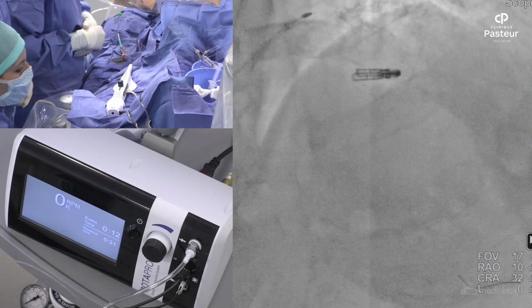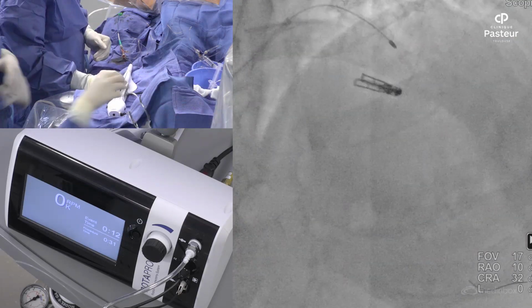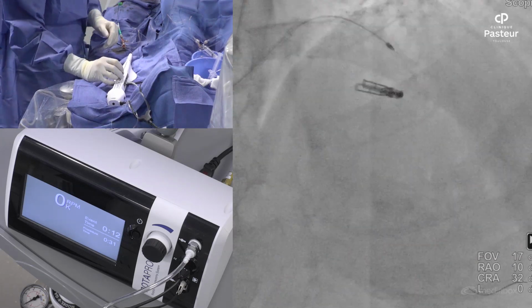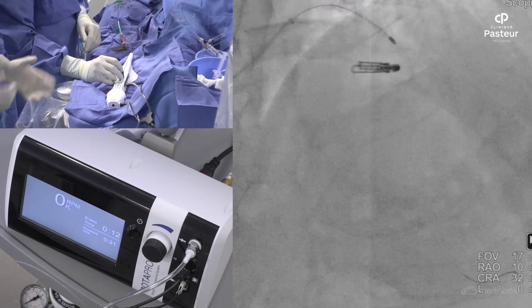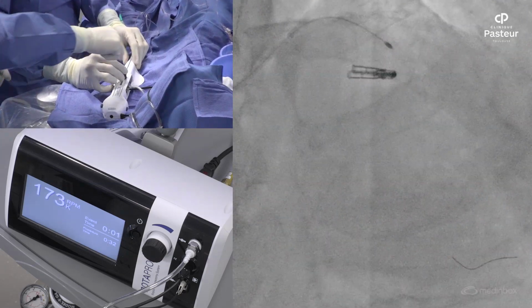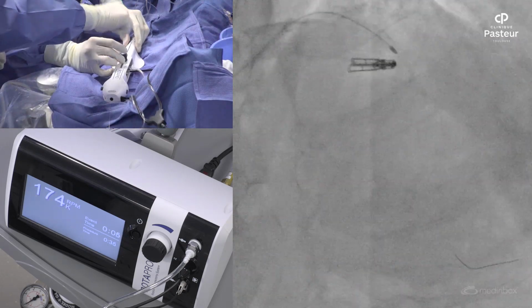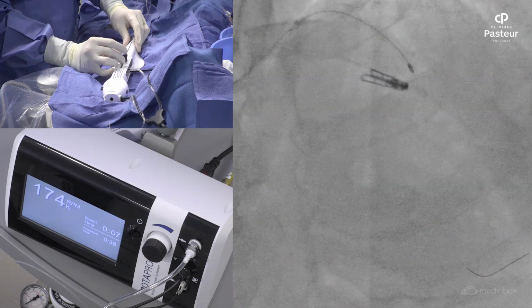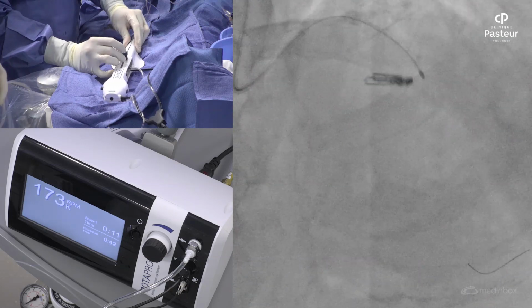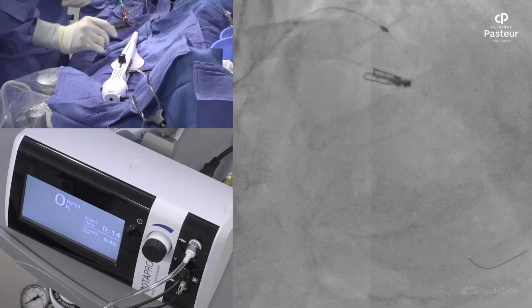So Benjamin, I see that you have the new RotaPro system, which for you, you take it for granted. But not everybody has the new system. This is the great system without the pedal anymore. Yes, that's right. We forgot to describe the system, but you see, we now have just the button. So to activate the burr, we just have to push on this button, and then we advance gently, just by a pecking motion. It's still the same technique, and you see it's quite gentle rotablation.